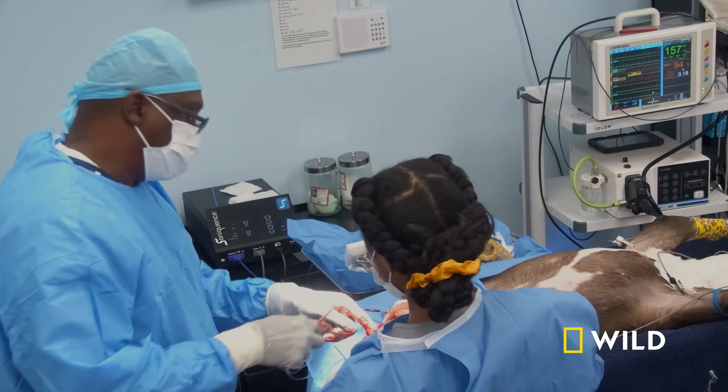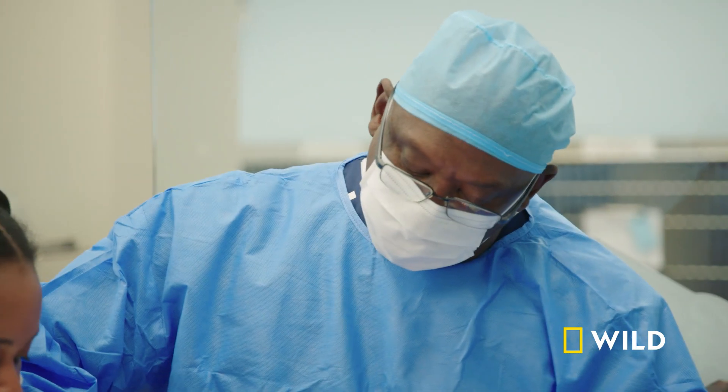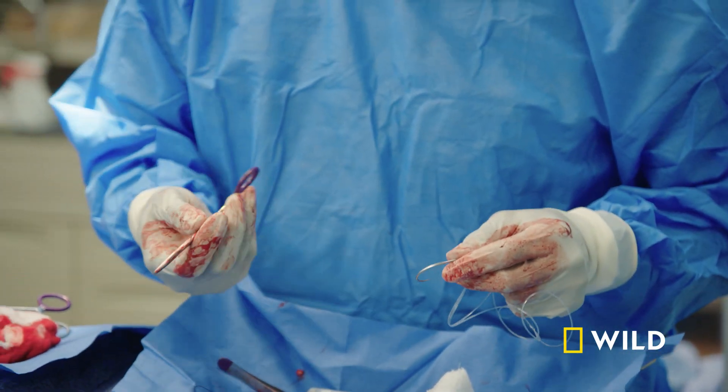So we're gonna get our suture. We're going to do an extra capsular repair — we're going to stabilize this knee. We use a prosthetic ligament, kind of like a fishing line, and we put it in an angle that stabilizes the joint.